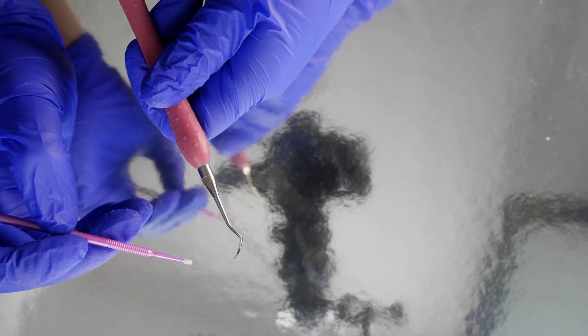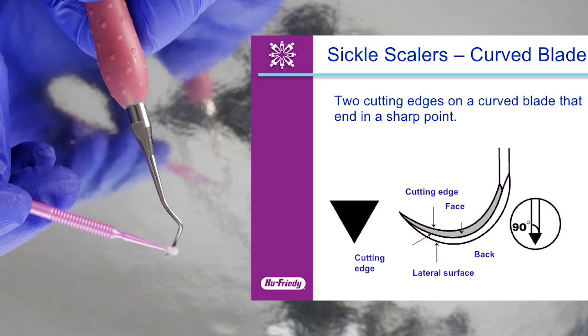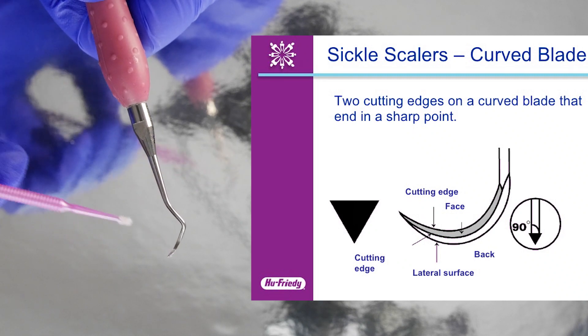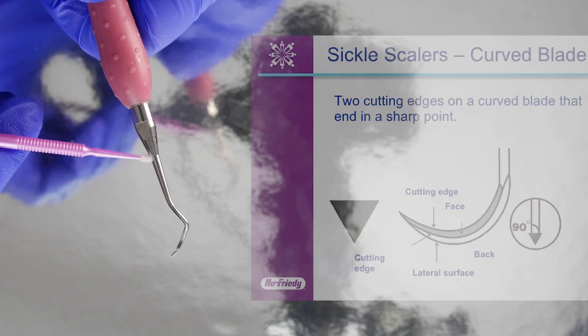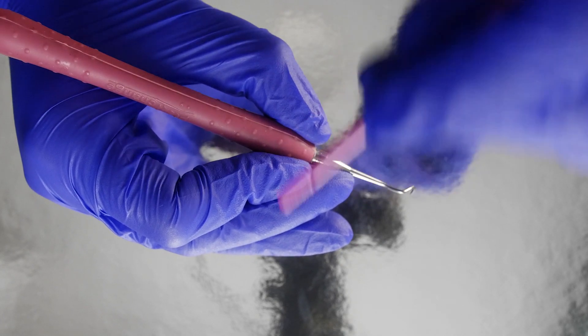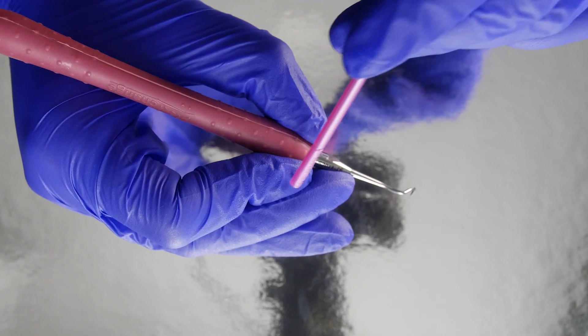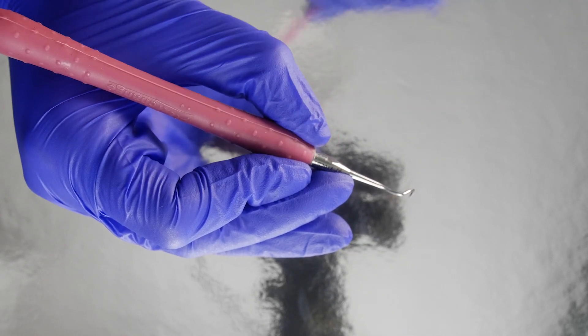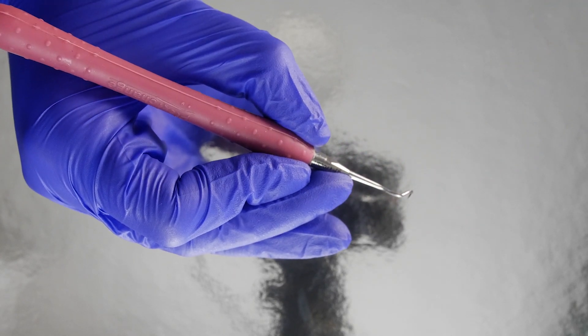So the first thing we need to look at is the different parts of the instrument. Here we have the sickle scaler with its different components. This is the pointy sharp tip — you can see it's really sharp. We've got the face and the two cutting edges, which is what we'll be removing the calculus with. We've got the terminal shank and the functional shank. So the first thing we've got to get right is the modified pen grasp. In this grasp, all the fingers are working together as one unit. You have the thumb and the index finger opposite each other on the handle. The third finger is on the shank and the fourth finger will be acting as the fulcrum and finger rest.